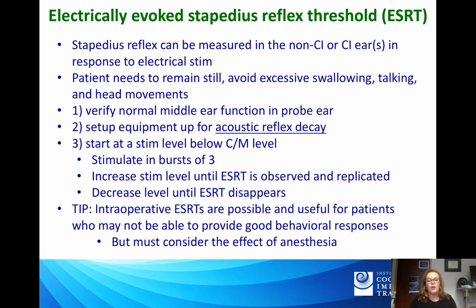As you recall from your days with standard hearing assessments, when you're doing any type of admittance testing, the patient does need to remain pretty still. You basically tell them try to avoid swallowing, at which point they immediately have to swallow, the power of suggestion. And then you want to have them sort of avoid talking and excessive head movements.